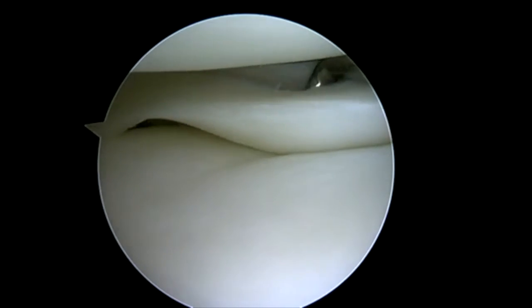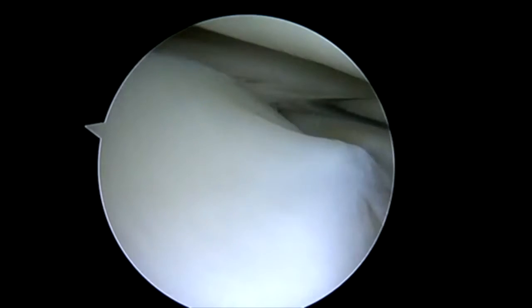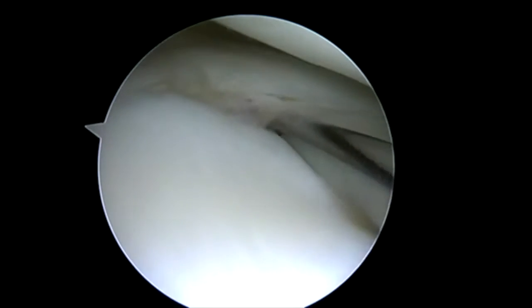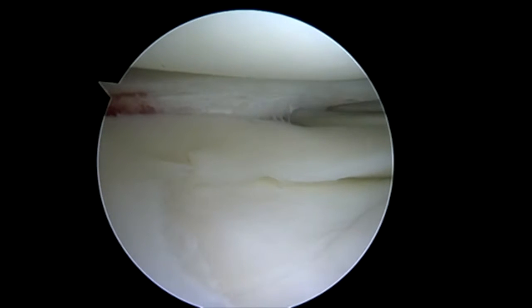Hi, I'm Dr. Chris Doherty. I'm a sports medicine fellowship trained orthopedic surgeon at the Agility Center in Bentonville, Arkansas. Here we're going to demonstrate the repair of a bucket handle tear of the lateral meniscus in a 16-year-old patient with a NovaStitch Plus device. So we've defined our meniscus tear.